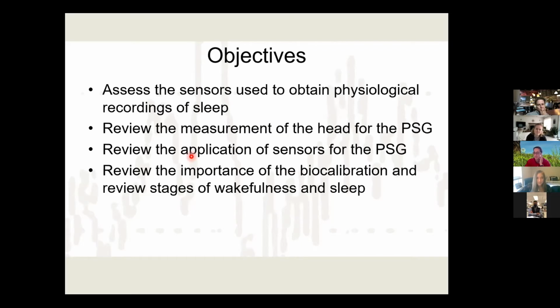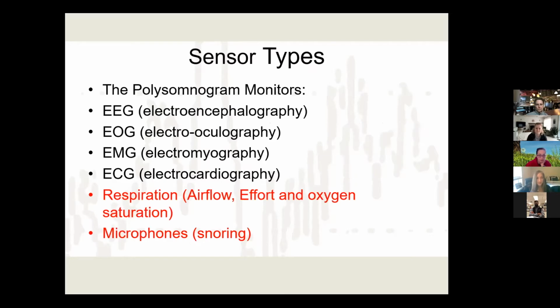So the objectives for today: we're going to assess the sensors that are used in PSG recordings. We'll go over how you actually measure the head for a hookup. We'll go over how you apply the sensors for a hookup. And then at the very end, we'll go over biocalibrations and look at a few examples of different PSG recordings.